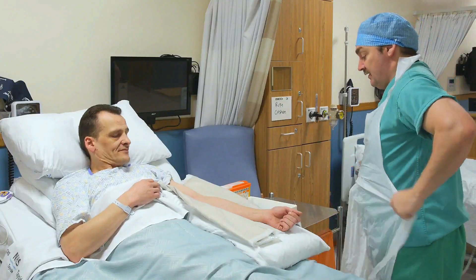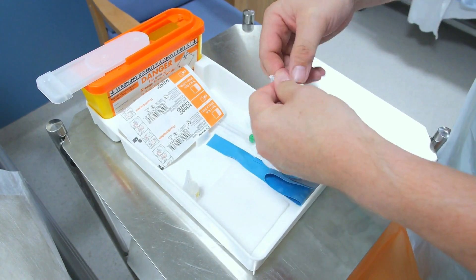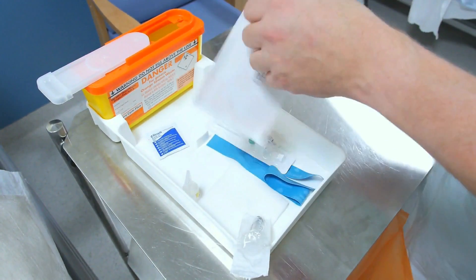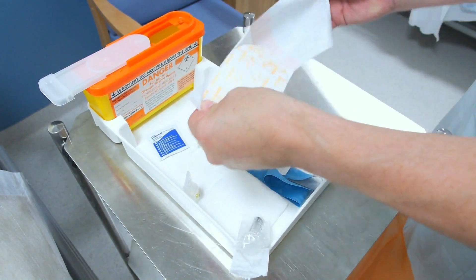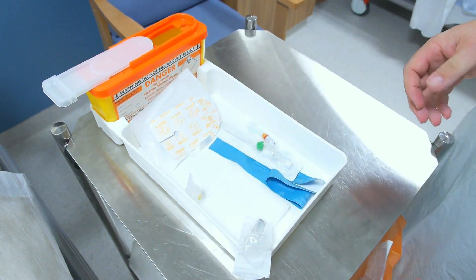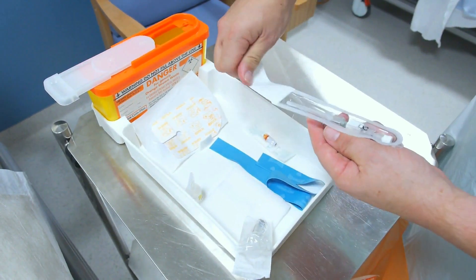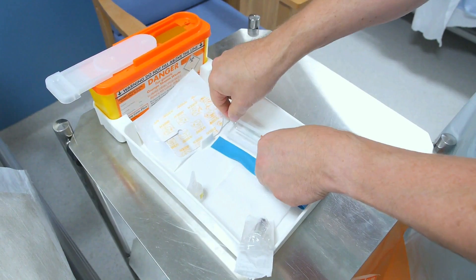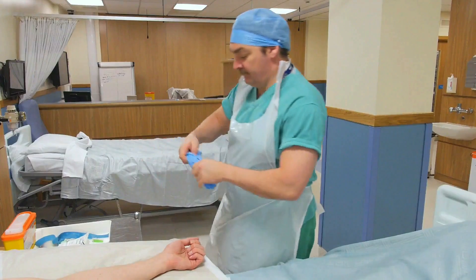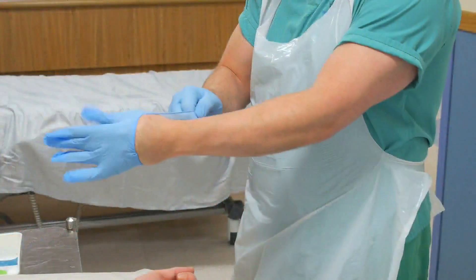Having prepared the patient, don a disposable apron and ensure all the necessary equipment is in position. It's important to be organised, so open and prepare a syringe and then a sterile waterproof dressing. Ensure you have the correct size of cannula for the patient's age, the reason for insertion and their condition. Prior to cannula insertion, don a pair of well-fitting gloves.